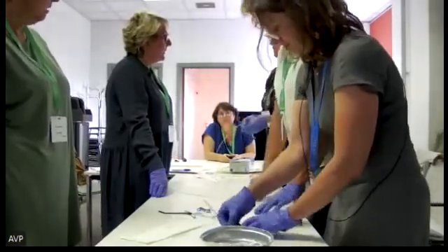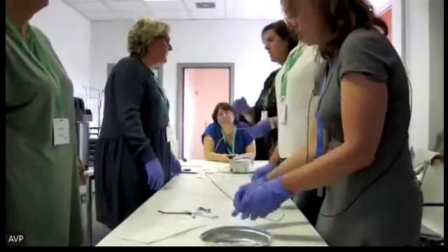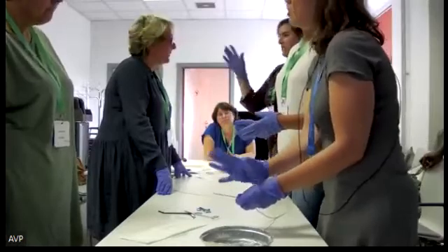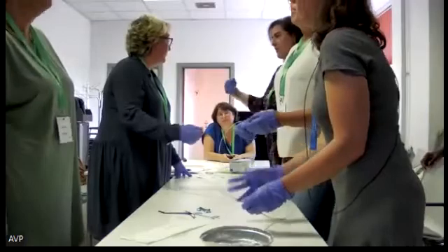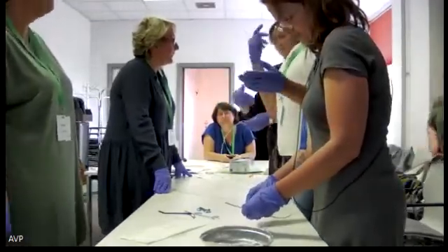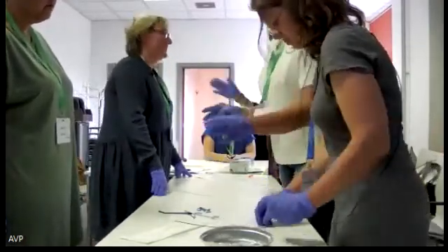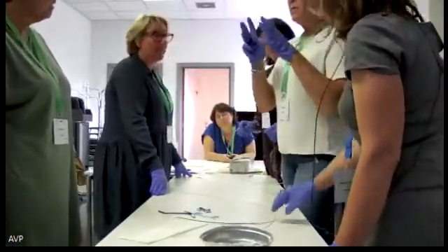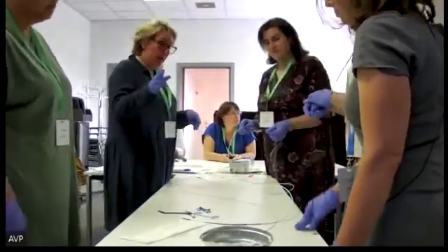Diffusionner, vraiment le faire à la fin. So we diffusion the thing at the end, because sometimes you can use this, if you want to bring back the stent, if your system is fused still, you can still bring back a bit the stent, reposition, which you cannot do once you've released everything. And if the stent is too short or too long, you can remove it and place another one. So the diffusionner to release the 2 centimeters, really just before releasing the stent, when you're ready.